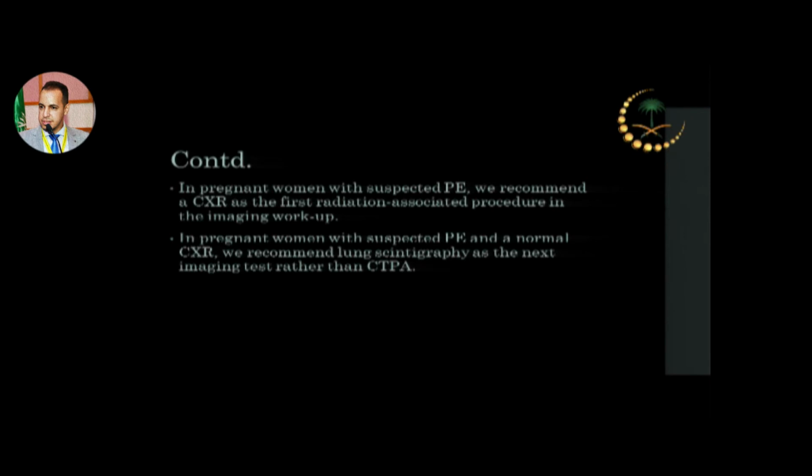The other use of the chest X-ray in pregnant patients is also to decide, should I go for a CT or go for a nuclear scan? Studies have shown that if the chest X-ray is abnormal, the incidence of a non-diagnostic VQ scan is much higher than if the chest X-ray is normal. So if the chest X-ray is normal, it's advised in general to go for a VQ scan. If the chest X-ray is abnormal, it's advised to avoid VQ scan because most likely you'll end up with a non-diagnostic study, and therefore it's advised to do a CTPA instead of a VQ scan if the chest X-ray is abnormal.